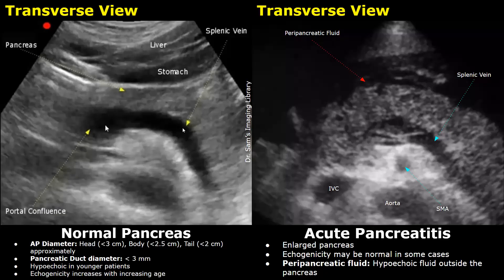This is the splenic vein behind the body and tail. The superior mesenteric vein and splenic vein join together to form the portal confluence, or SMV and splenic vein confluence. In the image on the right, we have a case of acute pancreatitis.